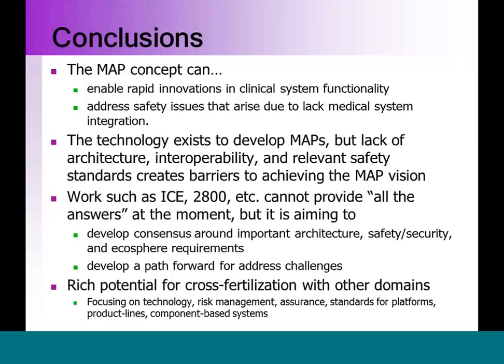No. If I were designing the perfect system like this, I would have a framework where a clinician could program up the expected workflows they're expecting to follow in their caregiving context, and I would have that married with the ability to quickly stitch together and simulate the logic of the system. Then they would be able to model check or simulate the contextual interactions with the application logic. Issues would be reported back to them in a language that makes sense to them.